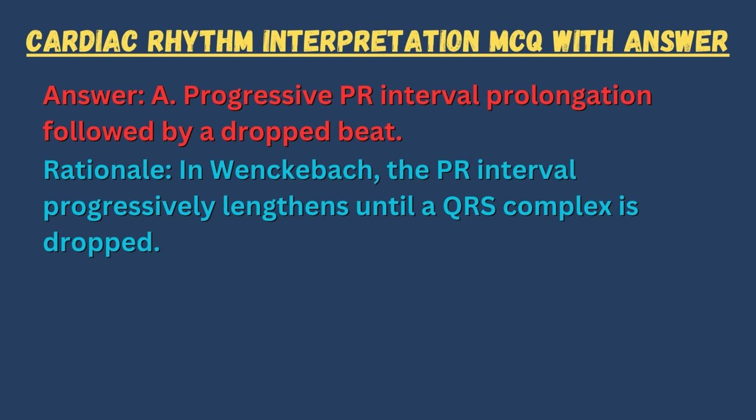Answer: A. Progressive PR interval prolongation followed by a drop beat. Rationale: in Wenckebach, the PR interval progressively lengthens until a QRS complex is dropped.